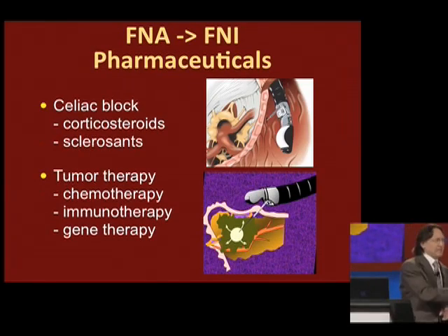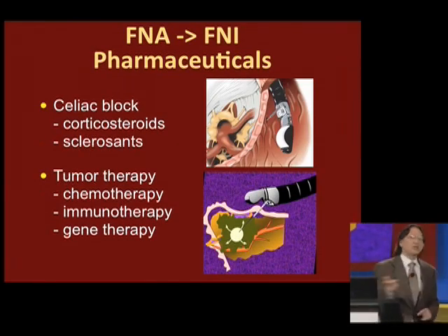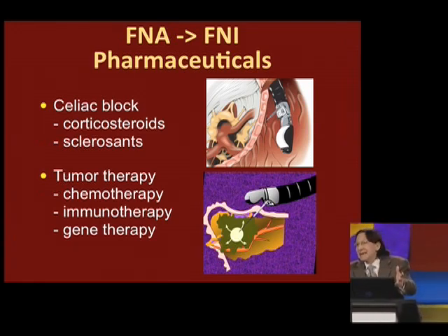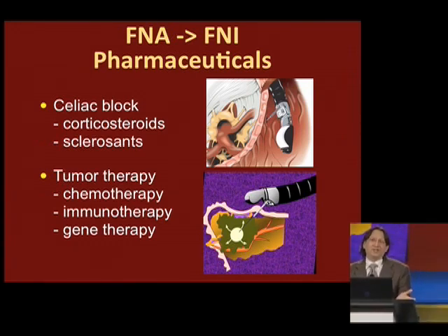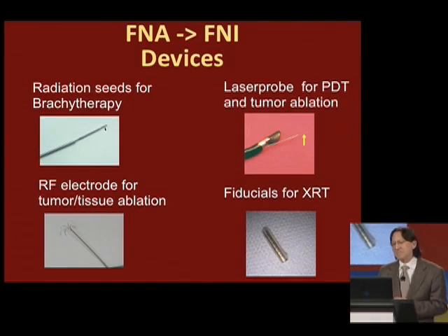FNA then quickly evolved to a therapeutic procedure with FNI, using the same fine needle injection, using the same needle. So rather than aspirating fluid, let's inject a fluid, a substance, a pharmaceutical. So we can perform celiac blocks. We can perform tumor therapy by injecting chemotherapeutic agents or immune reactive agents. Lots of exciting therapeutic possibilities.